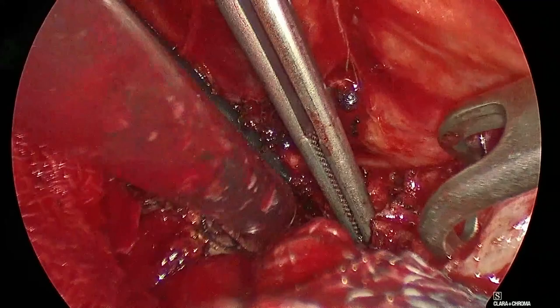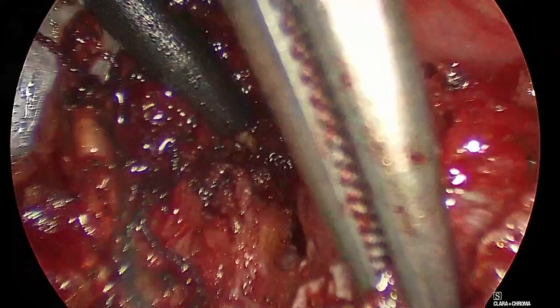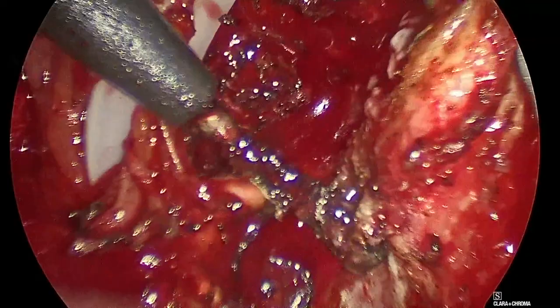Marcus, before you stop, I just want to show you, remove the suction. If you go in, you see the bladder. So this is the bladder open. We see perfect. So okay. It's a very good result.